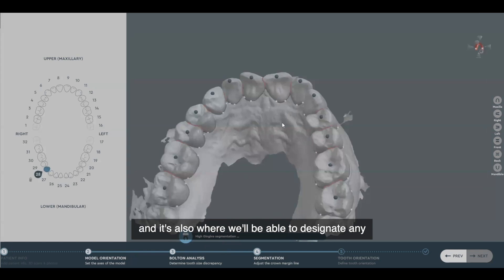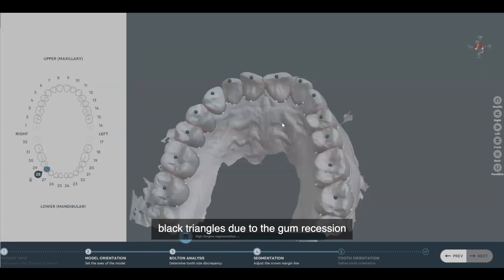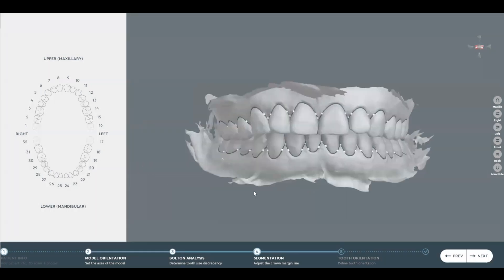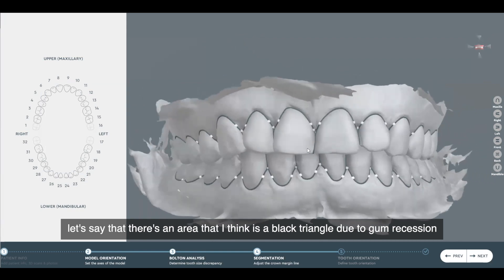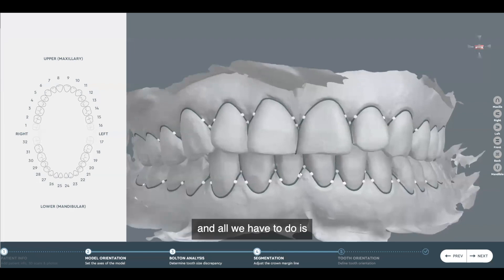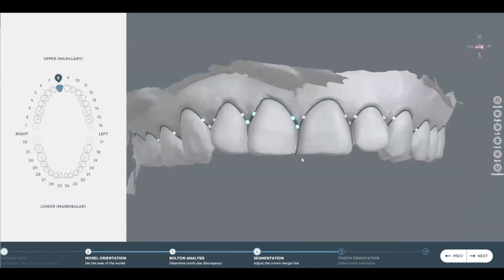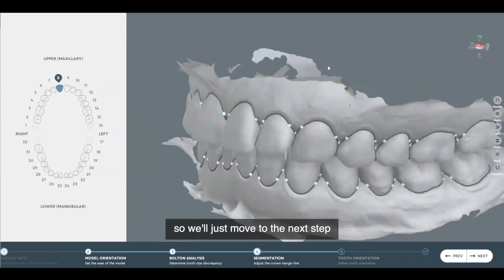Now it's moving into the high gingiva segmentation, which is where the software evaluates the interproximal areas and discards any artifacts or unidentifying marks that are not part of the tooth. It's also where we'll be able to designate any areas that may be considered black triangles due to gum recession. We can zoom in and if there's an area that I think is a black triangle due to gum recession, all we have to do is click in the interdental area and move the bullet to designate a black triangle or high gingiva. The software identifies everything pretty well, so we'll move to the next step.